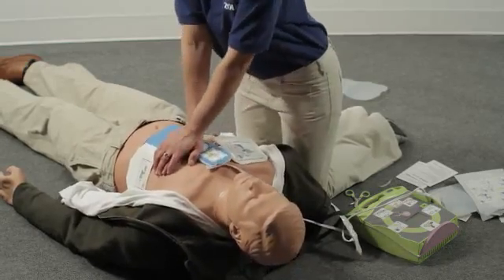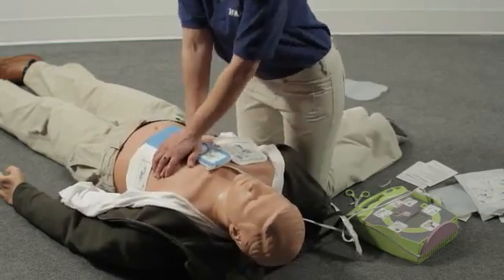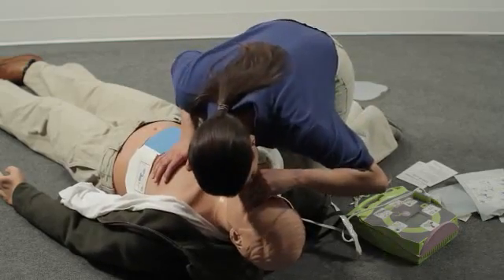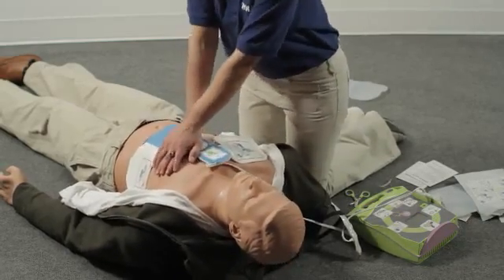Compress the chest hard and fast 30 times. Give 2 breaths. After 2 minutes, you will have completed about 5 full cycles of 30 compressions and 2 breaths. Continue to follow the AED prompts.